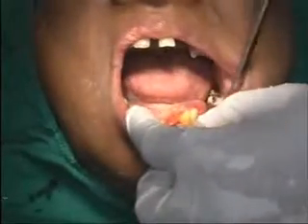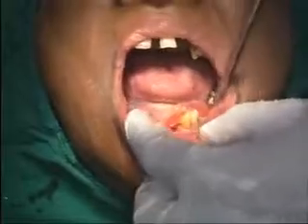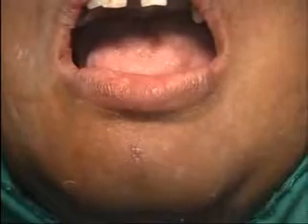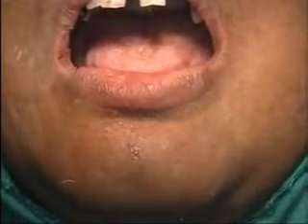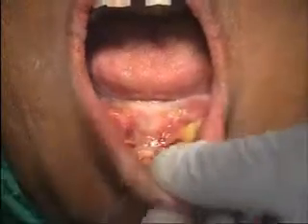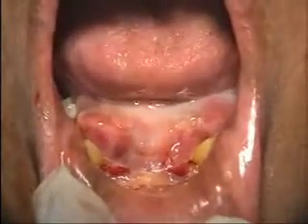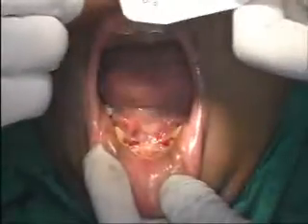Yes, my teeth. This is chill, right? It is — I told you. The amount of drilling you have to do is minimal, nothing really. So he gives me the implant. That's the implant packaging — it gives you the batch number, date of expiry: July 16, sterile, barcode and all those things are there.